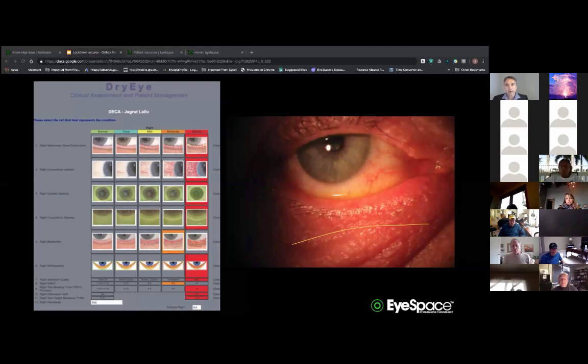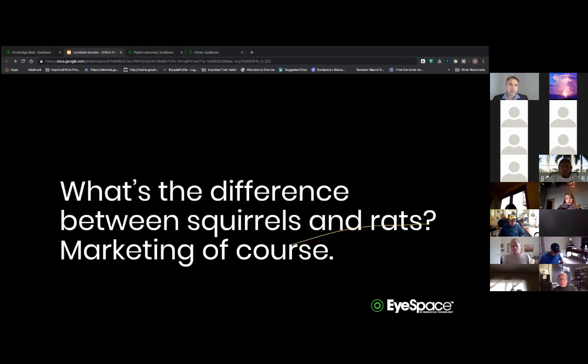Most patients will complain about morning decreased visual acuity that throughout the day starts to improve. So the practical thing I'd like to tell all my patients, and this comes from hard-learned lessons, is when they wake up in the morning to instill an artificial tear over the contact lens, and then using the bottom lid, just gently nudge the lens until the seal's broken and allow enough time for fluid to flow in underneath the lens. The patient will feel this as the lens starting to move freely, and then take the DMV remover and remove the lens, and just helps to protect the epithelial layer from that adherence process.